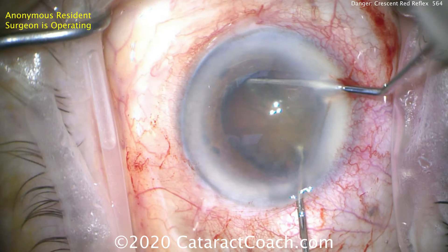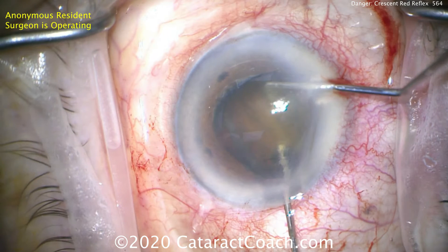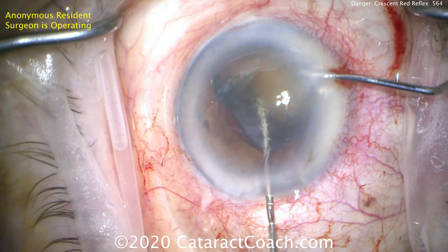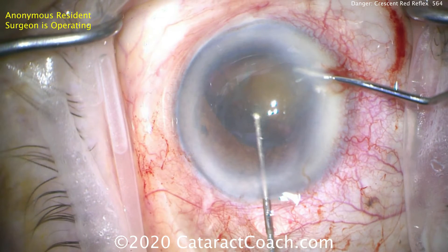Let me show you that again here in slow motion. Lifting that up — there it is. Right there. A fraction of a second you saw that flash.